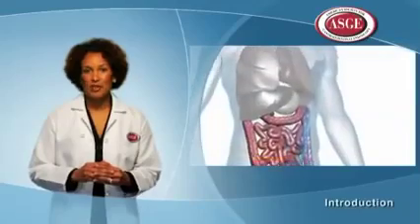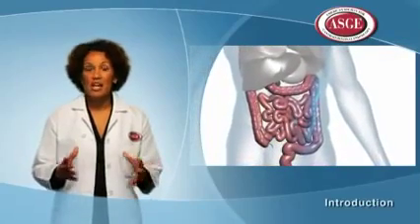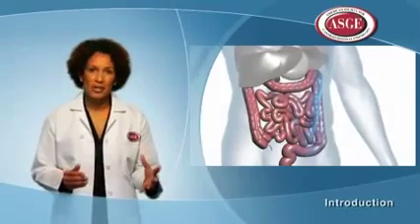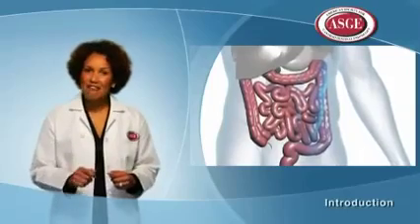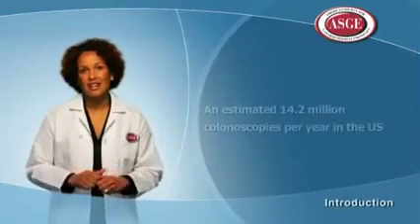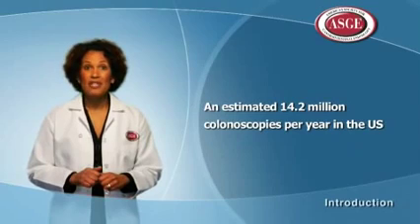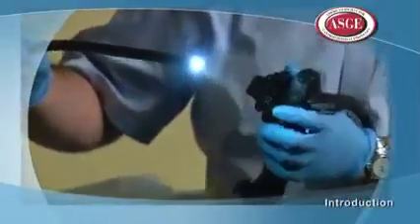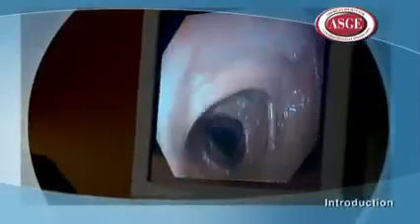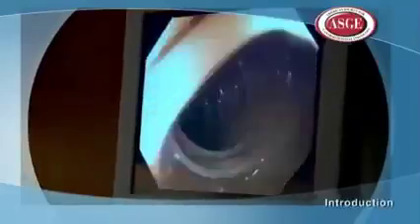Colonoscopy is a procedure that we use to look at the large intestine, also called the large bowel or colon. Colonoscopy has been around since the 1970s and is a safe, effective, and well-tolerated exam. There are about 14 million colonoscopies done in the U.S. each year. A colonoscope is a flexible tube with a small camera and a light on the end that allows a doctor to see inside your colon. Pictures are transferred from the colonoscope to a TV screen that your doctor watches to find abnormalities.